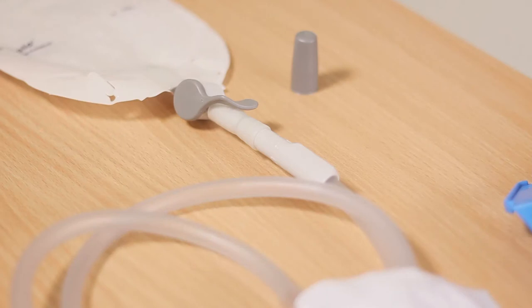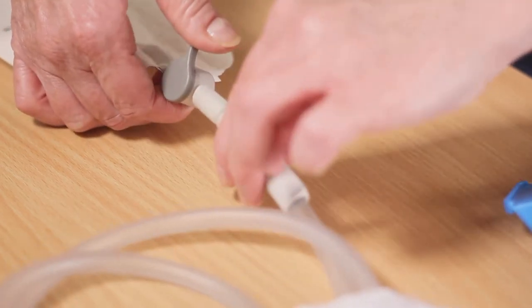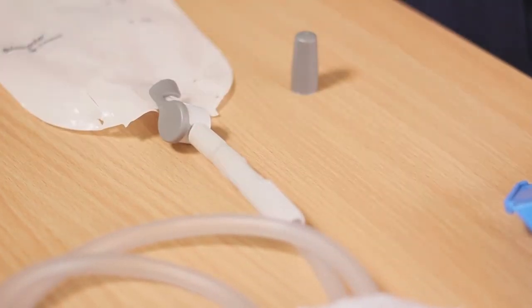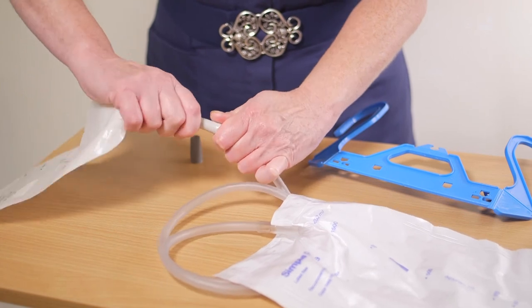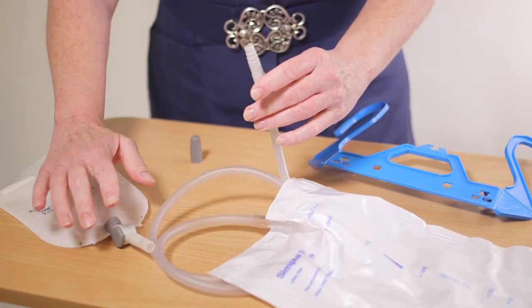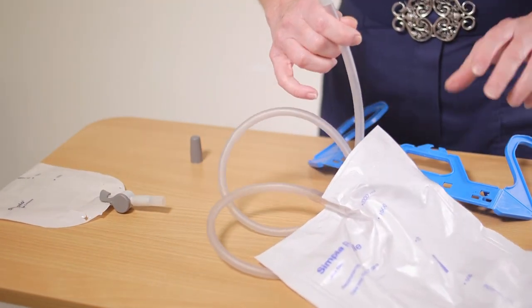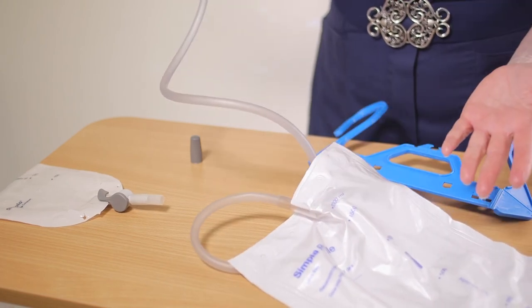In the morning turn off the tap at the bottom of the leg bag. Disconnect the night bag and empty the urine into the toilet from the night bag.